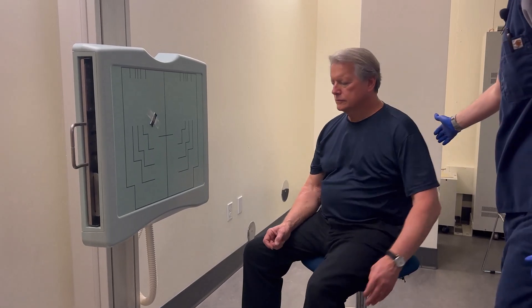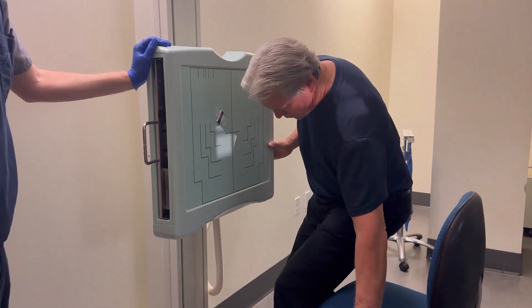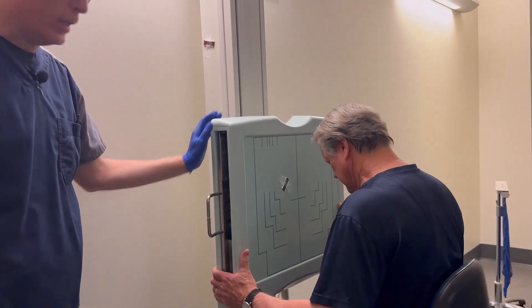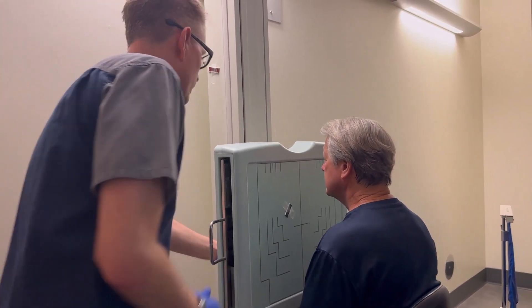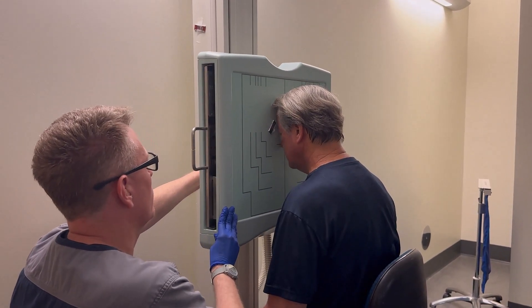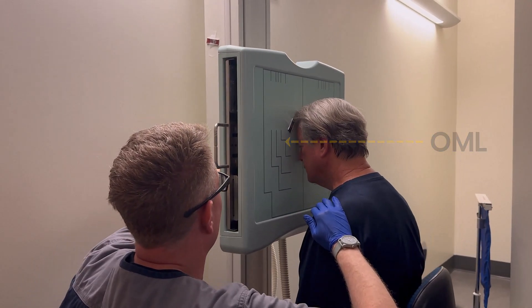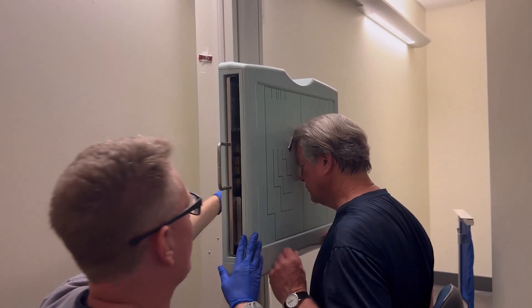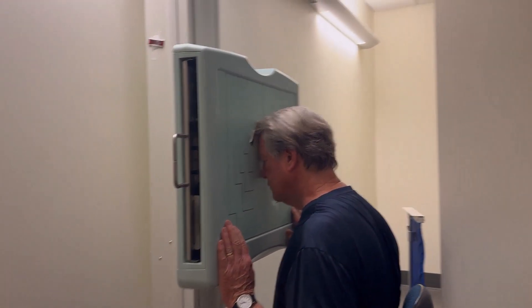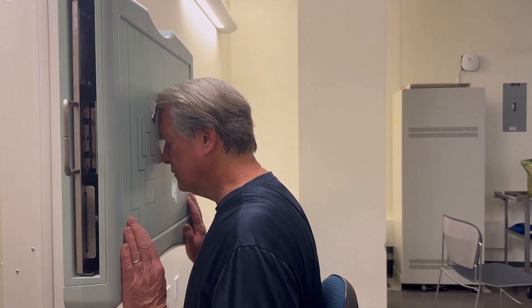You're going to have your patient facing the board — this is done PA. The cranial line we want to use is the orbitomeatal line, so your patient is pretty much going to have their forehead resting against the board. Get in close, tuck your chin down. We want the central ray exiting at the nasion, so I've just pulled my patient back a little so I'm not dragging their face up the board. OML is lined up, and I've already put my marker on the board.